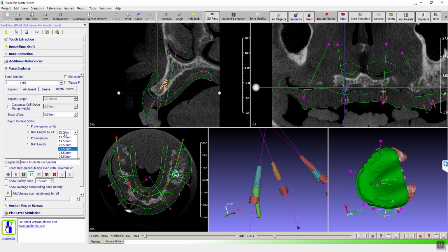Are drill kits set up that way? Yeah, they have multiple lengths. The only thing is the shape. The shapes are different. So that's the problem with the tapered drills. All right, yeah, I would be cautious before we go that way.